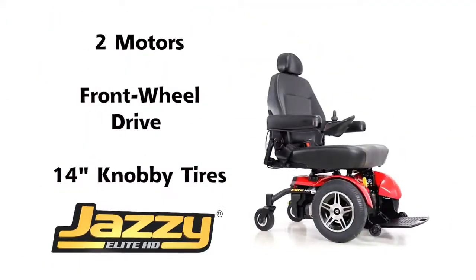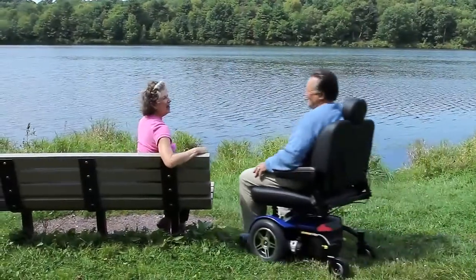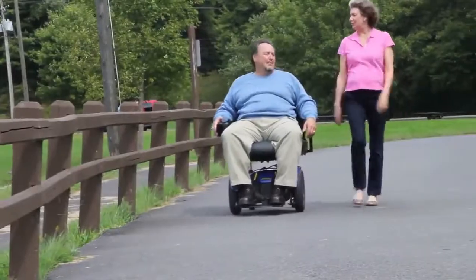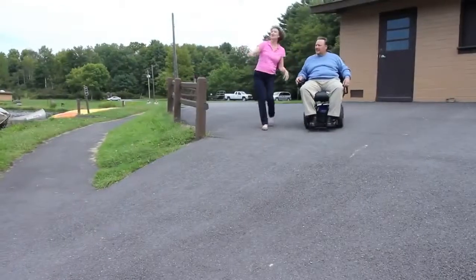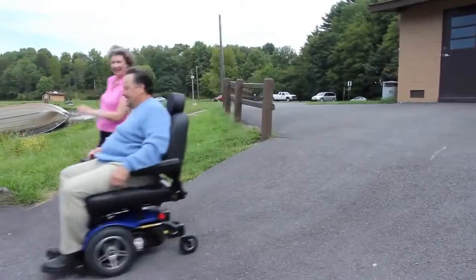A two-motor front-wheel drive design, 14-inch knobby tires, and optimum weight distribution provide outstanding traction and deliver a more aggressive drive profile, which is ideal for the bariatric community. A front-wheel drive unit provides more stability and a smoother ride for bariatric consumers.